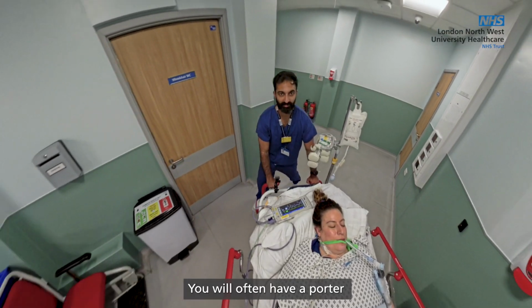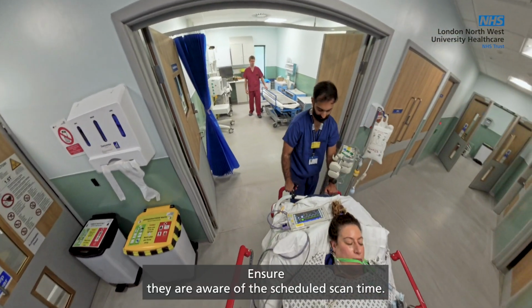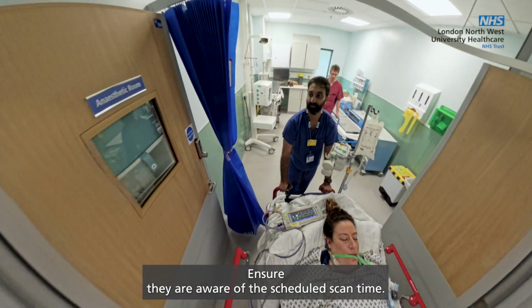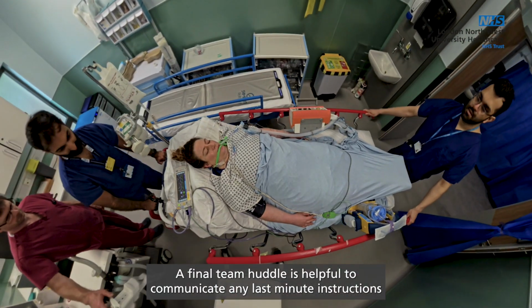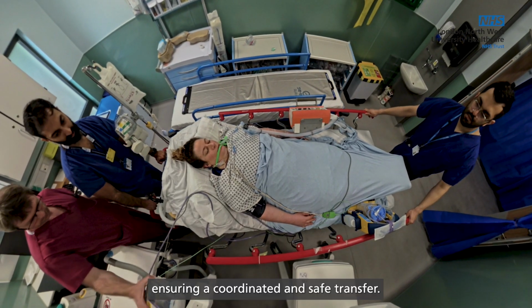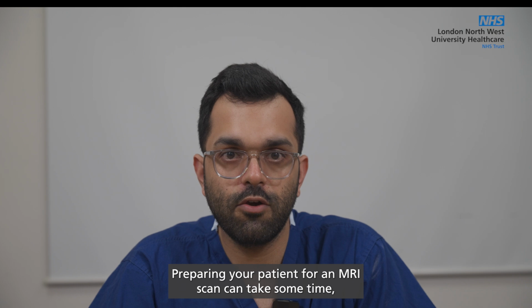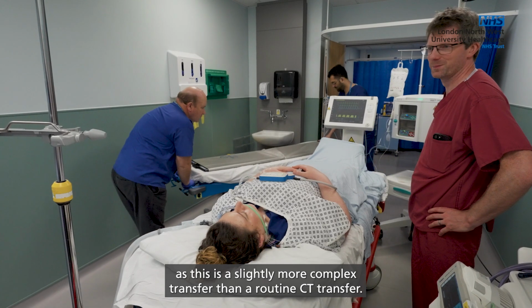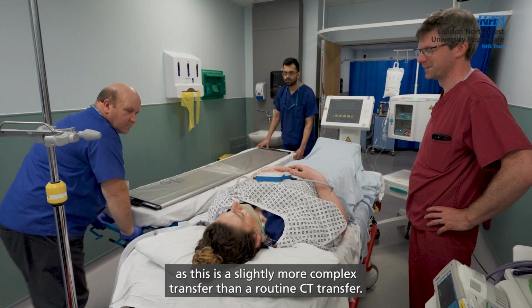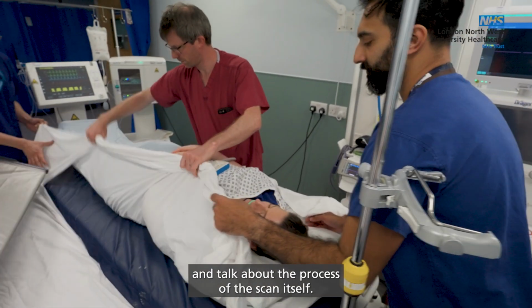You will often have a porter accompanying you on your transfer to the MRI. Ensure they are aware of the scheduled scan time. A final team huddle is helpful to communicate any last-minute instructions, ensuring a coordinated and safe transfer. In summary, preparation is key. Preparing your patient for an MRI scan can take some time as this is a slightly more complex transfer than a routine CT transfer. We will now move on to our final section and talk about the process of the scan itself.